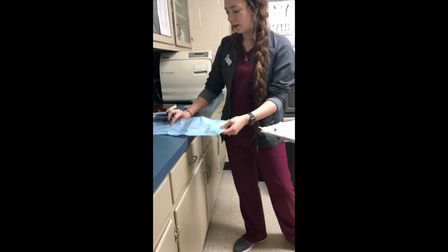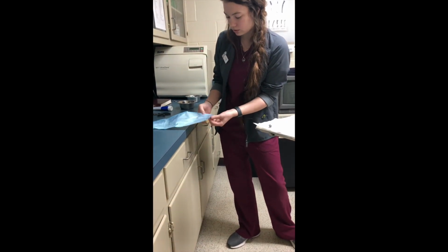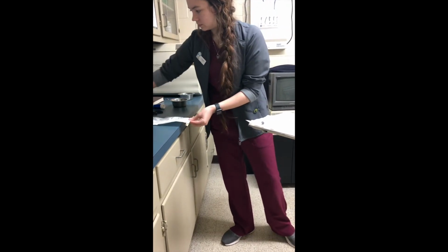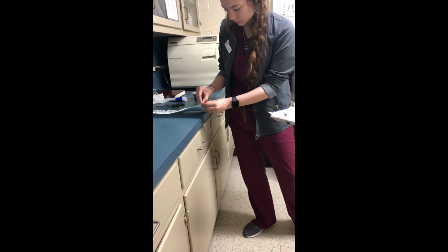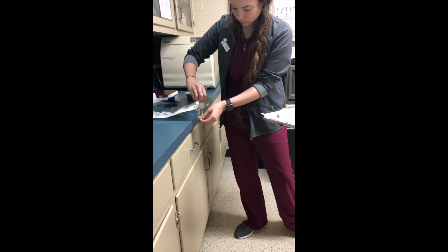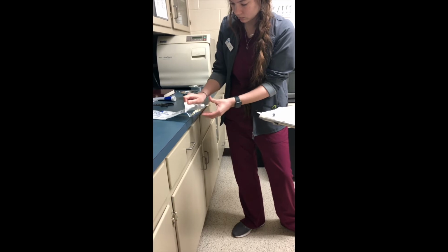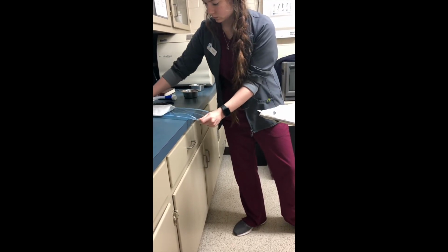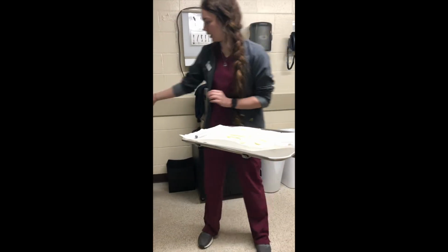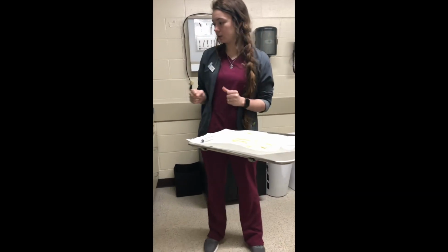And then over here, I have my polypropylene catheter that's been autoclaved, so it's sterile, ready to be used. So that is open, so I can grab that sterilely. Then I have Chlorhex scrub here and water that I'm going to use to prep the prepuce and the penis. And we'll get started.